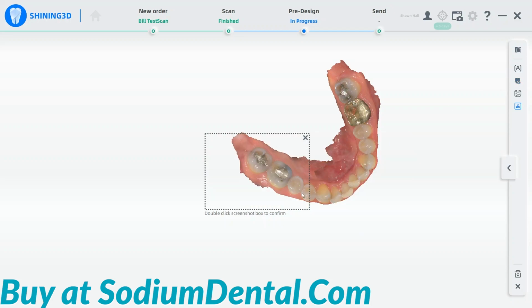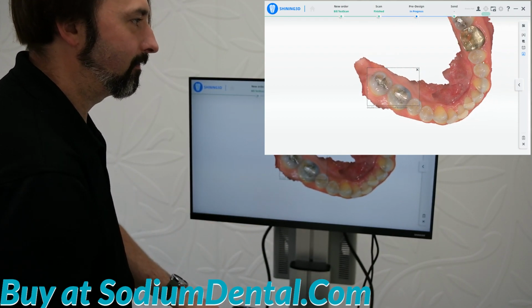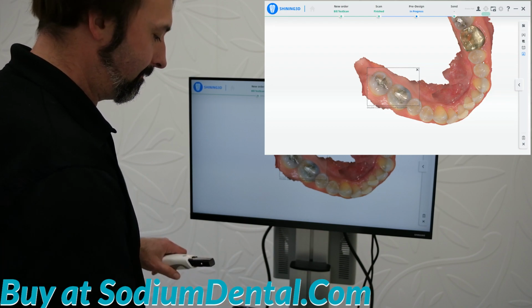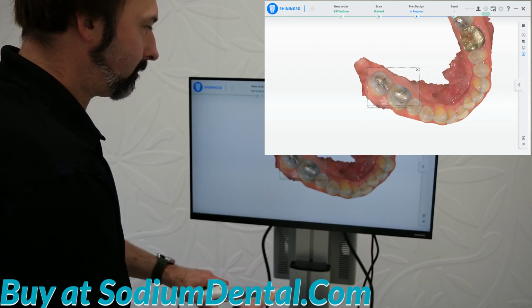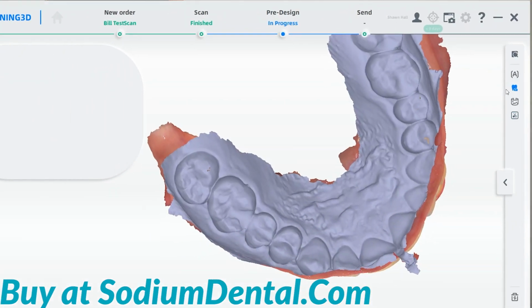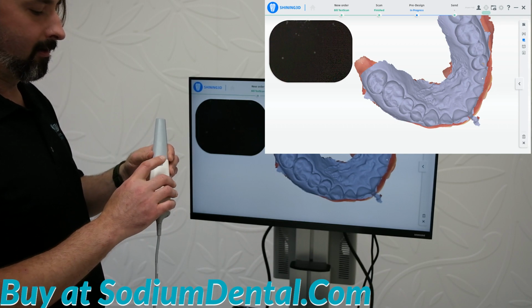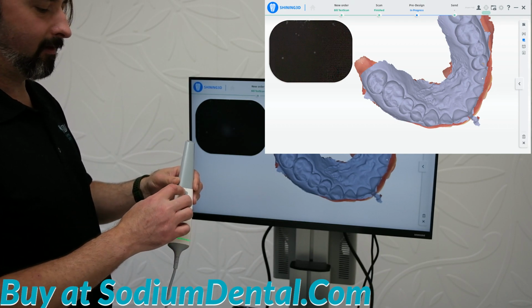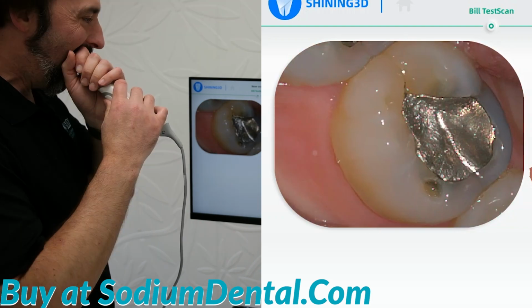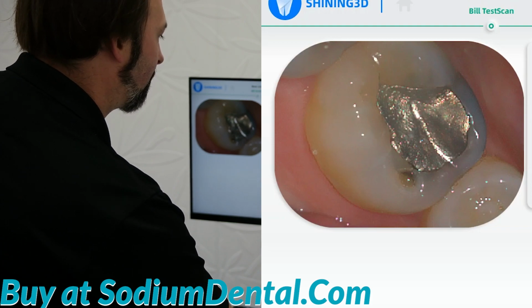Let's say instead of a screenshot of the model, you instead would like to take a picture of that part of the tooth. At which point, you put your scanner tip back on. You would select endoscope and use the scanner like an intraoral camera, with this button being your capture button. The gray button on the back will be your capture button, much like an intraoral camera. And you can also apply a note here.